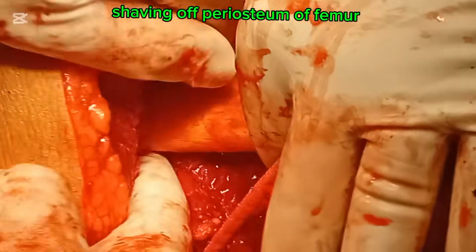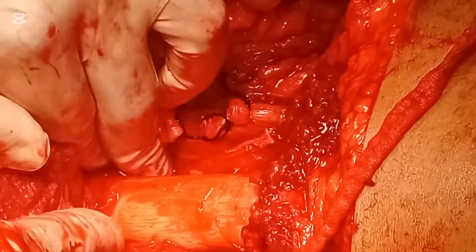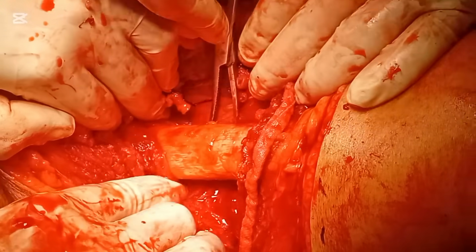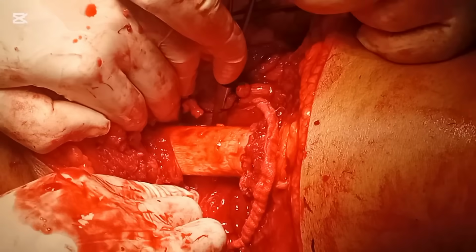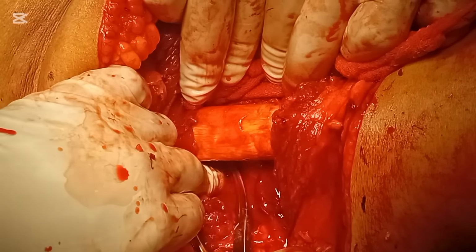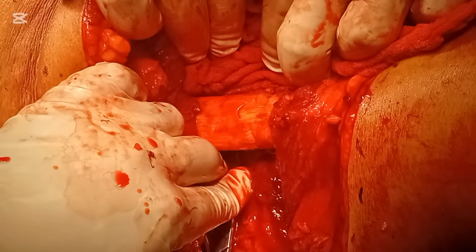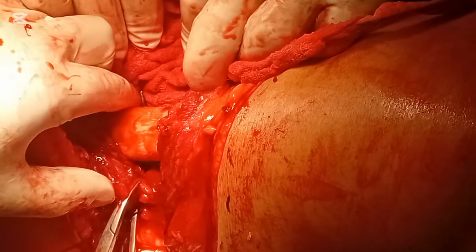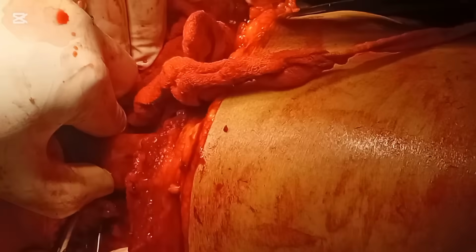The periosteum of bone is being elevated. Most of the time a periosteum elevator is used. It is used to separate the periosteum from bone so that the bone is easily cut and no hindrance comes out in the procedure.